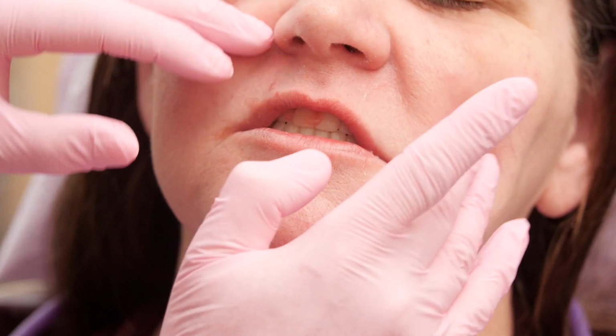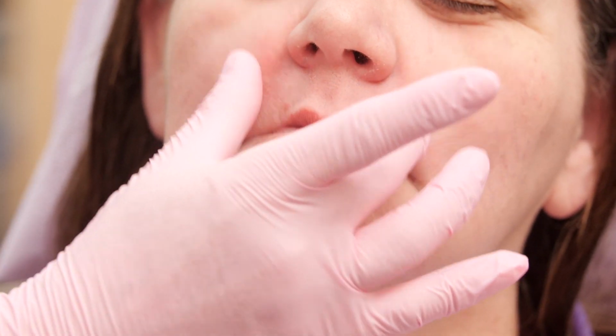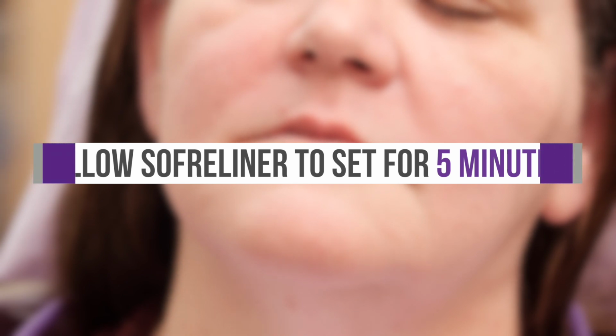In addition, we want to border mold the denture in order to capture the proper anatomy that will allow the patient to function well. Another important thing to remember is that the material requires a 5-minute setting time intraorally.